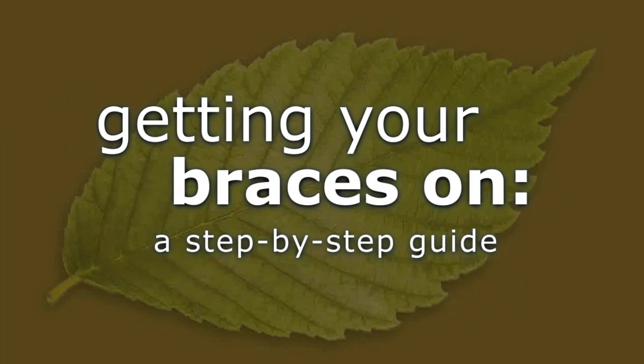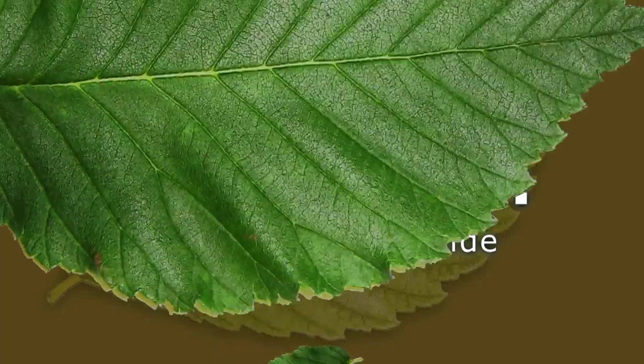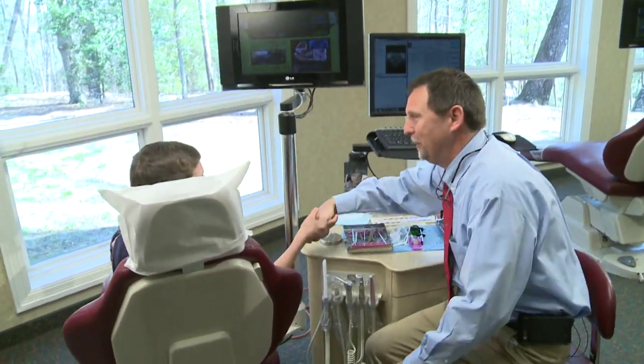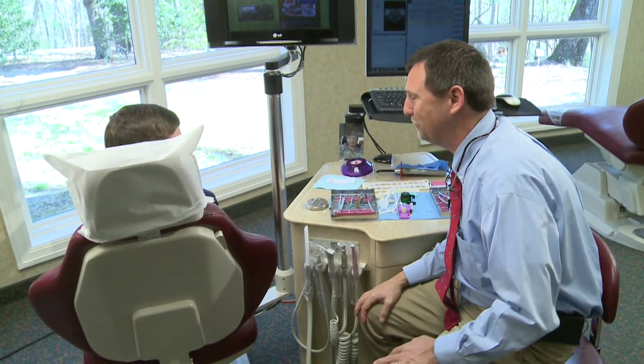With our state-of-the-art techniques and highly trained staff, putting on braces today is easier than ever. Hey Jacob, how are you doing today? Good to see you. We're gonna get some braces on today — you're excited! We're excited for you. This assistant is going to come over and start your braces and get things going for you.